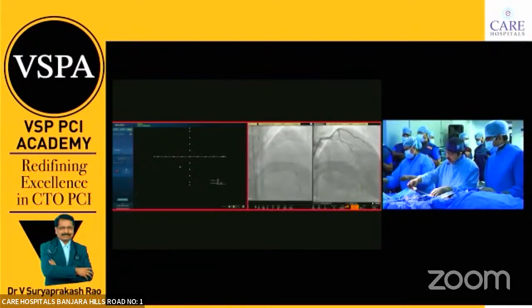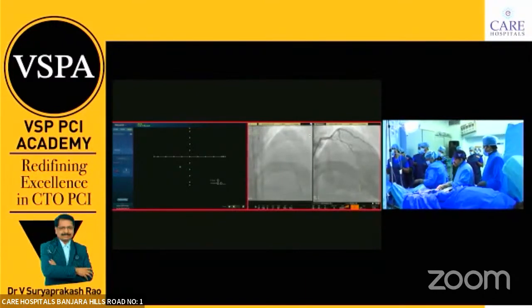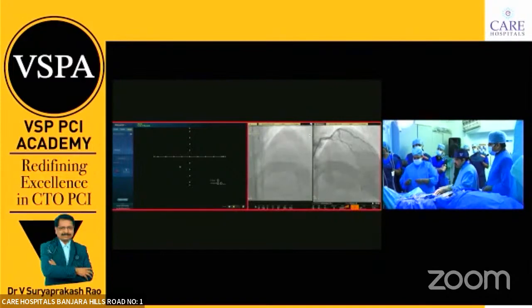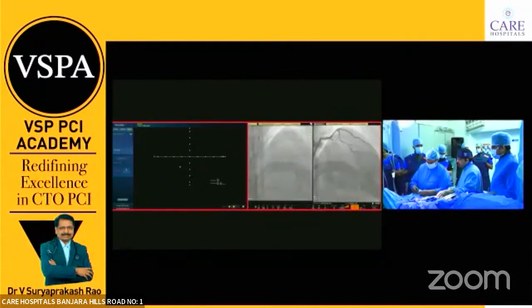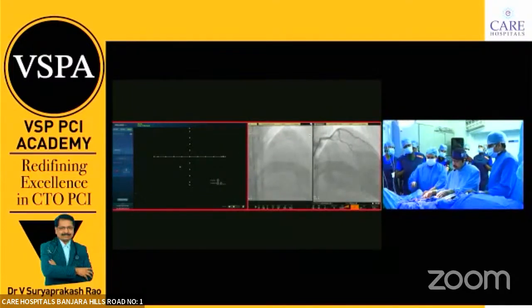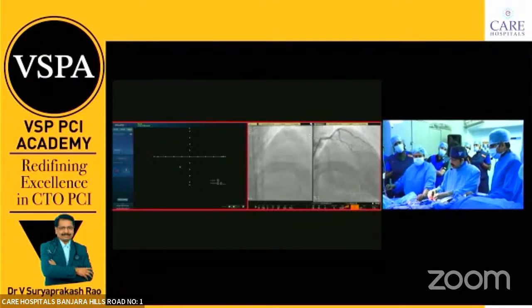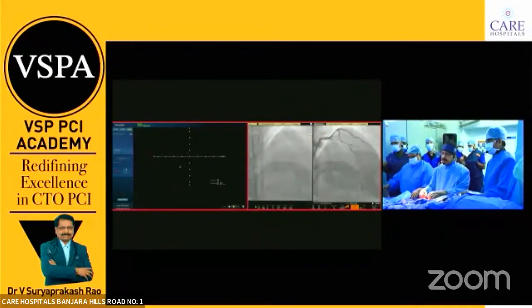There are two things. One is an automatic pullback and second is manual. It's a simple monorail system, a very short distance monorail that you should remember. Until your stiff portion comes, you have to be careful threading these IVUS catheters because you have to be in alignment with the Y connector and push it in line. That's very important until you get the stiff portion. Otherwise, a kink can happen in the catheter.